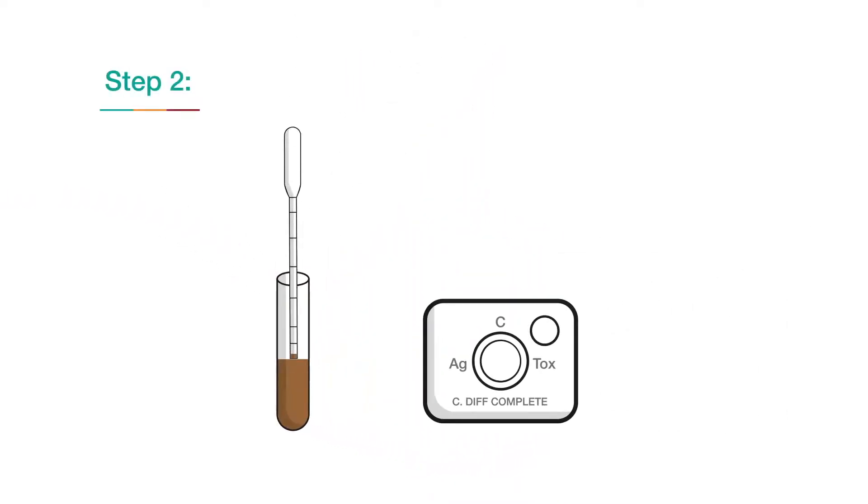Using a new, graduated transfer pipette, transfer 500 microliters of the diluted specimen to the small sample well on the Quick Check device.